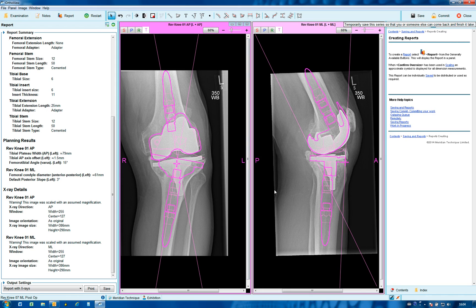This completes the tutorial on revision stem features added to total knee components.